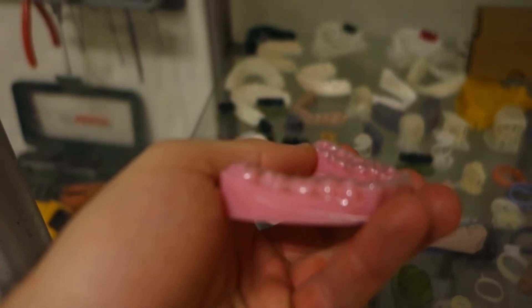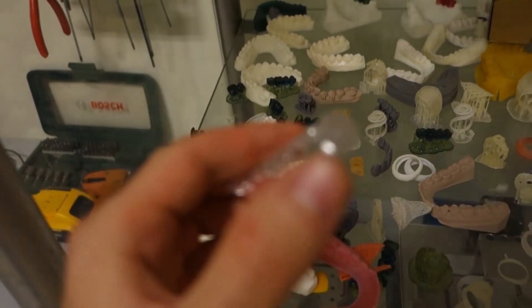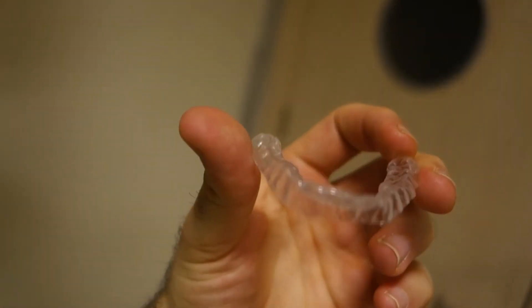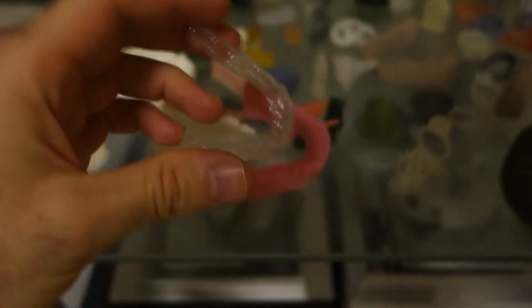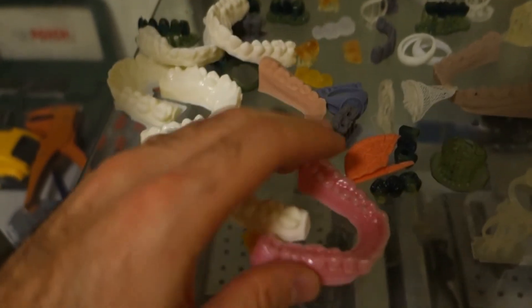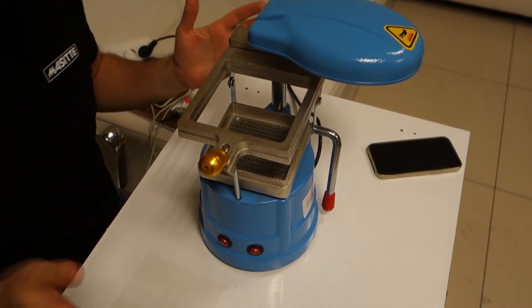After the vacuum aligner is ready, they cut it, clean it, and make sure it doesn't have any sharp edges that could cut or hurt the mouth. They ensure the aligner is completely ready, with no sharp edges, and that the tooth fitting is perfect.